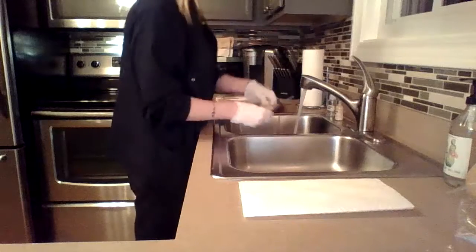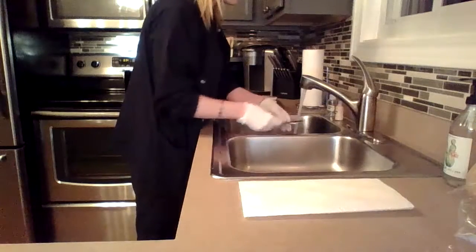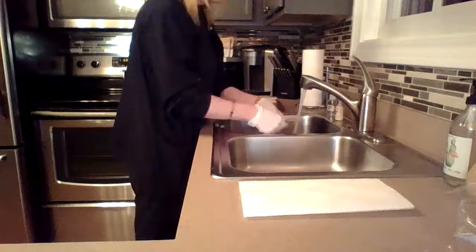What I'm going to start off by doing is rinsing each one of these instruments as thoroughly as I can ahead of time.